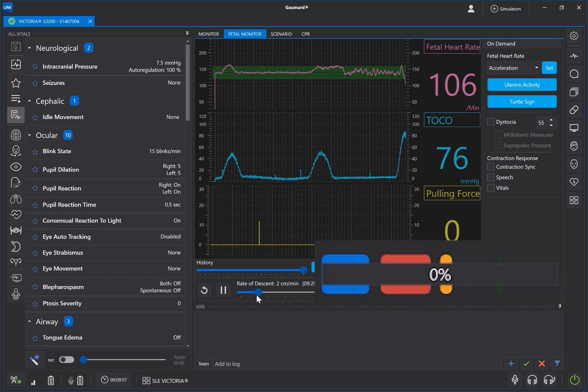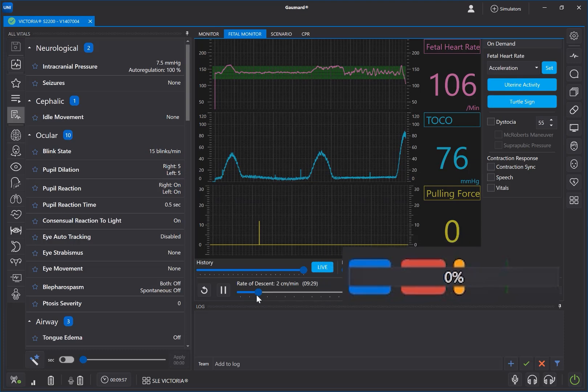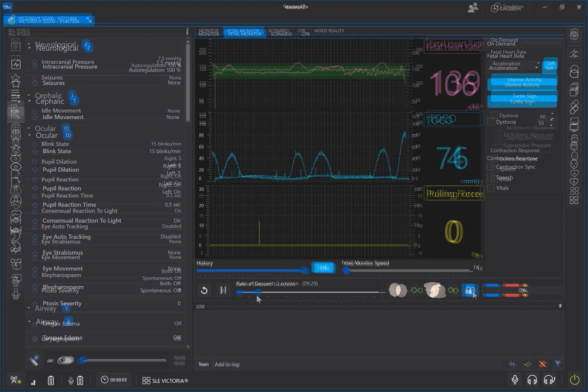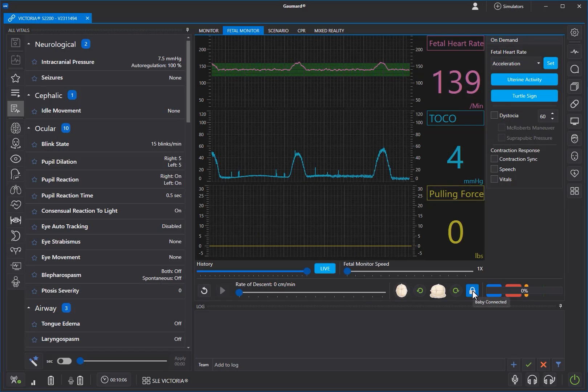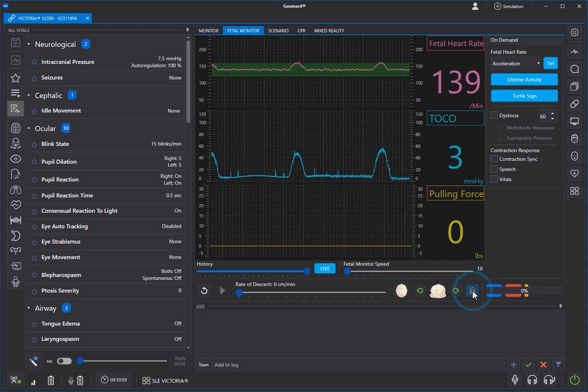The green line represents the push-to-end threshold, which simulates the final push to deliver the baby. To release the fetus lock mechanism before the end of a delivery, click the blue lock button.